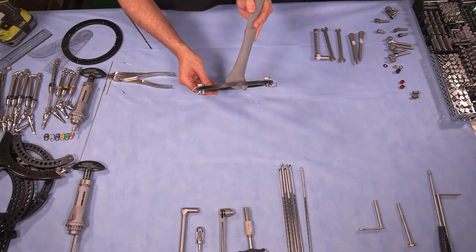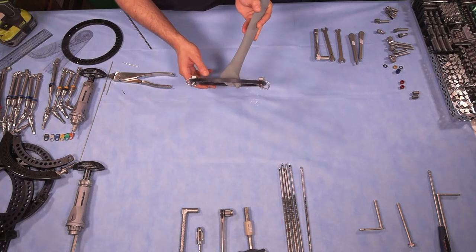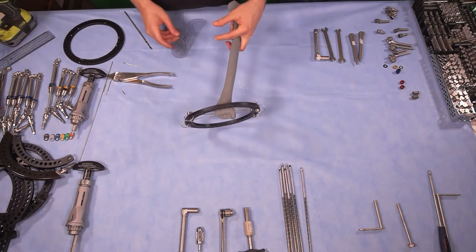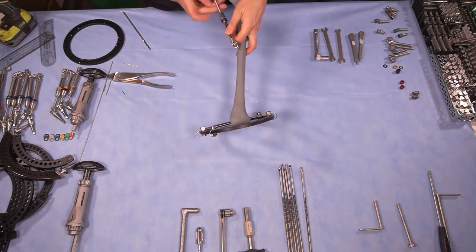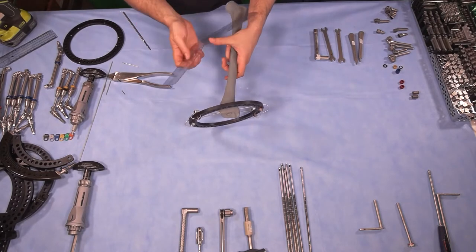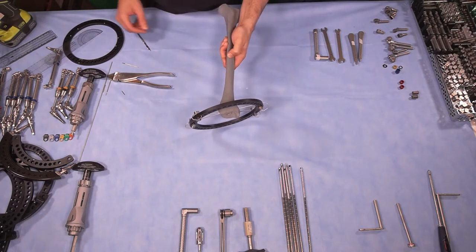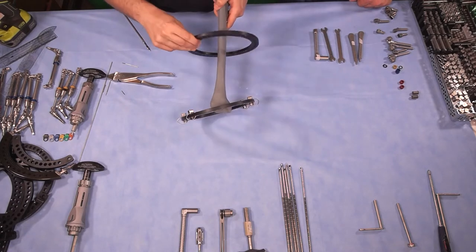This ring is stable enough and orthogonal to the joint line. We're now going to start suspending our proximal ring to keep our real estate. We're going to try to use all medium struts, and the middle of the scale for the medium struts in this system is 160 millimeters. So I'll measure 160 millimeters from the distal ring, which leads up to here — that's where I want my proximal ring.